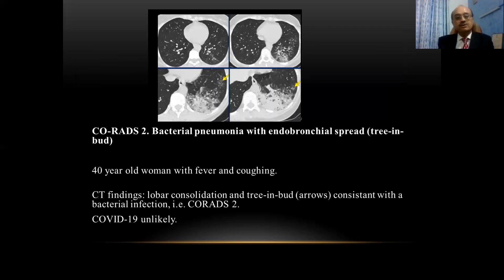This is also a case of CORADS 2 — a 40-year-old woman who presented with fever and coughing. The CT scan shows a lobar consolidation with tree-in-bud appearance, which is consistent with a bacterial infection or bacterial pneumonia. Though this is CORADS 2, it shows a typical bacterial infection and COVID-19 is unlikely here.